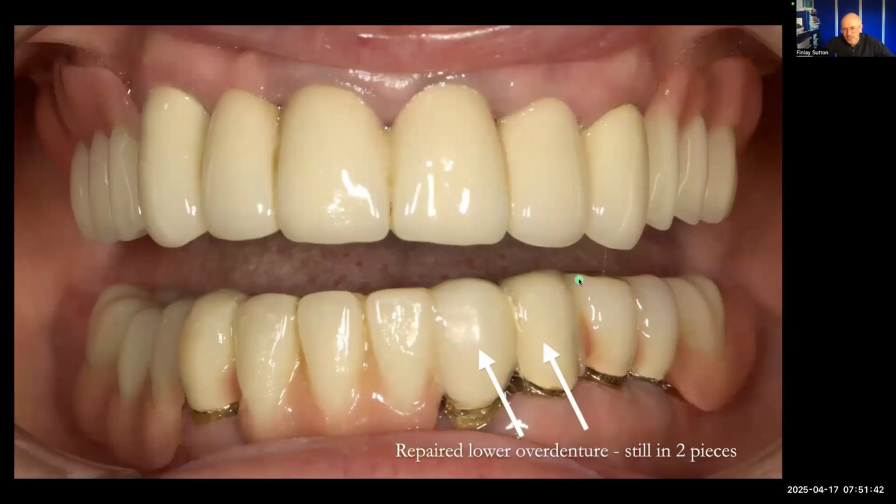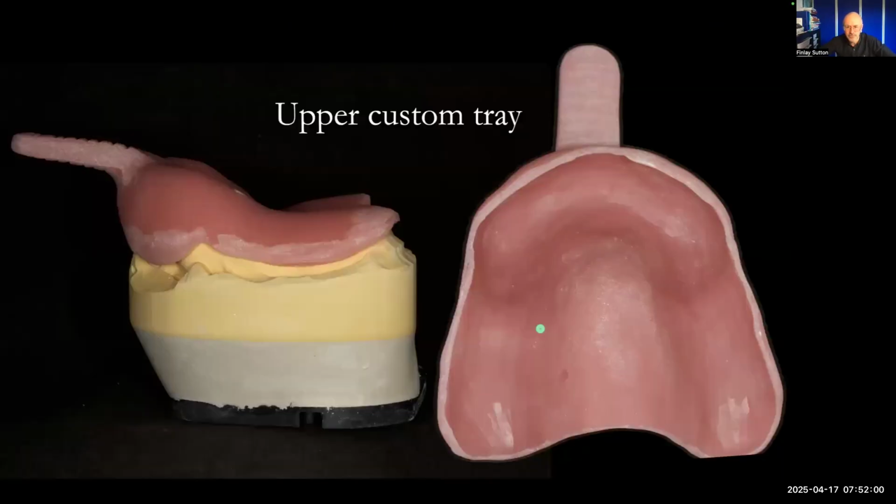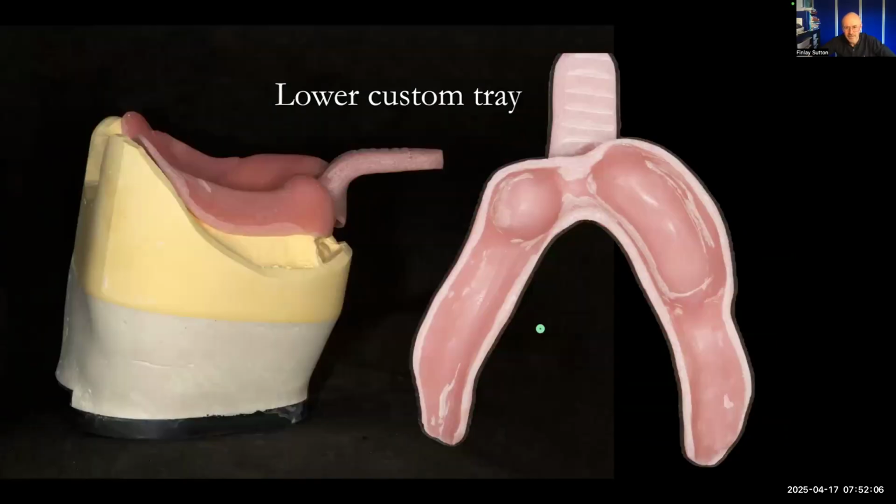Rowan repaired this just with some composites. This is the lower bridge, the lower overdenture. We didn't fix it. We didn't glue it together. It was still in two pieces, but you could pop it back in, and it looked better. And that's fine. We're not having to rush and get this stuff finished really quickly. This is my upper custom tray. That's my lower custom tray.